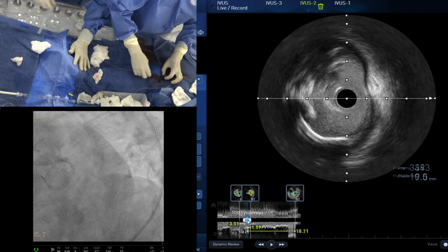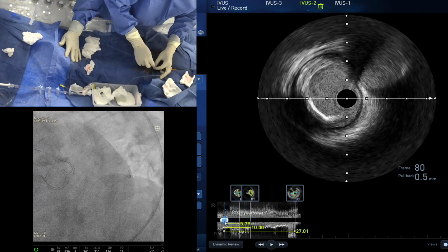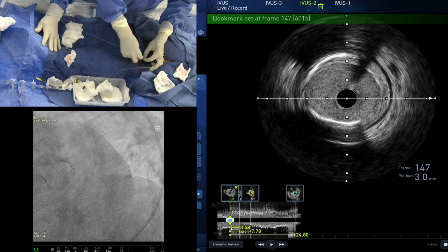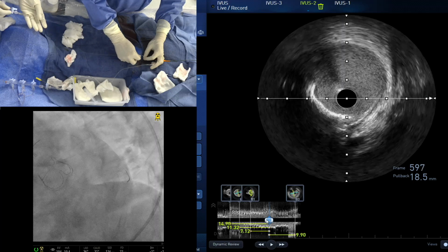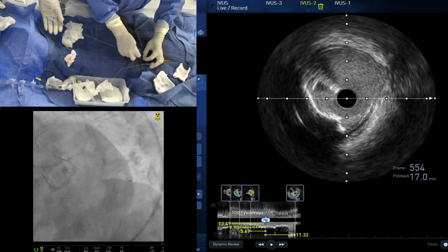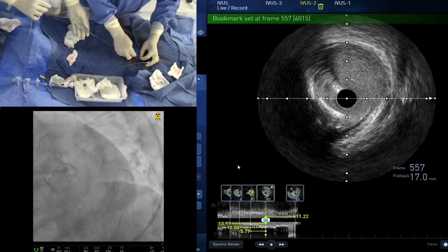I think that's a fair option. Or second, give a little gap from the ostial LAD, because the lesion was a little further down in the LAD, not at the ostium. Yes. How is the ostial LAD? Ostial LAD is patent. Then clear, then give a few millimeters gap so that no stent is abutting. So that's where the whole question happens when you put in a double stent approach: a higher chance of thrombosis, particularly with a thrombocytopenic patient.